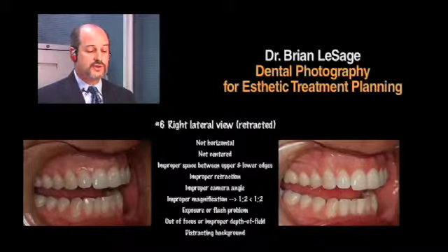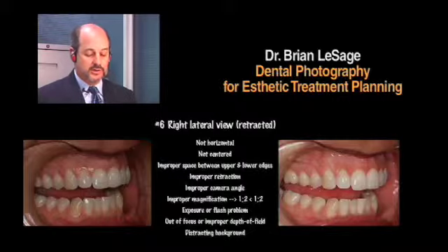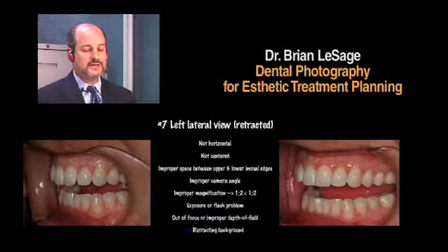So now view number 6, the retracted right side, teeth separated, the lateral splitting the X and Y plane. Again, really trying to get consistency in your photographs so you'll be able to diagnose all your cases based on a consistent system in your office. That's what I like to teach to, systems that we create in offices for consistency, really, for reproducibility. Same view from the left side, teeth separated, nice retraction. Try to retract a little further. You'd certainly like to at least see the first molar.